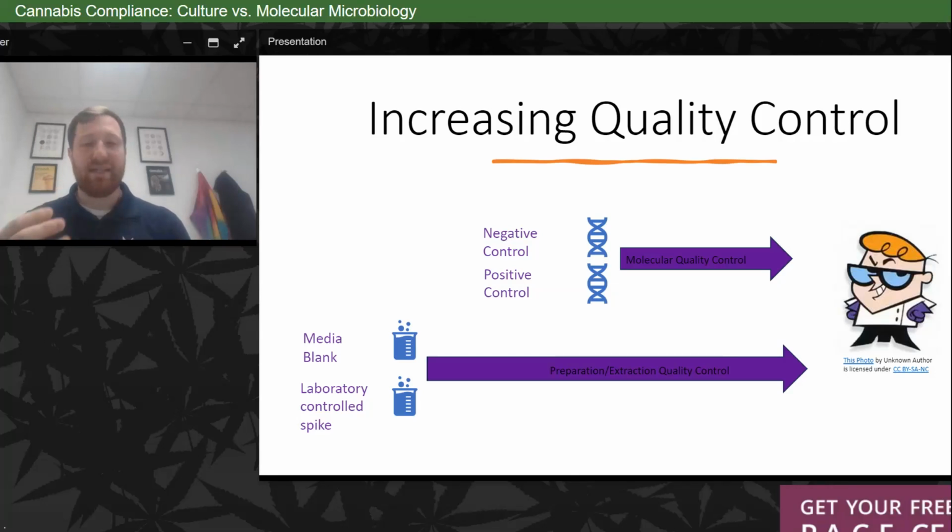And so what you're really testing here is to see if the instrument is performing. If we look at QC from a molecular standpoint, the blank will come back negative. The laboratory controlled spike, if we're testing for Salmonella, so we spike with an appropriate amount of Salmonella, shows positive at the end. So I can conclude that my method and my extraction were viable for target organisms. And then I look at my negative control and my positive control, showing that not only did my method work, but also the instrument is working appropriately.